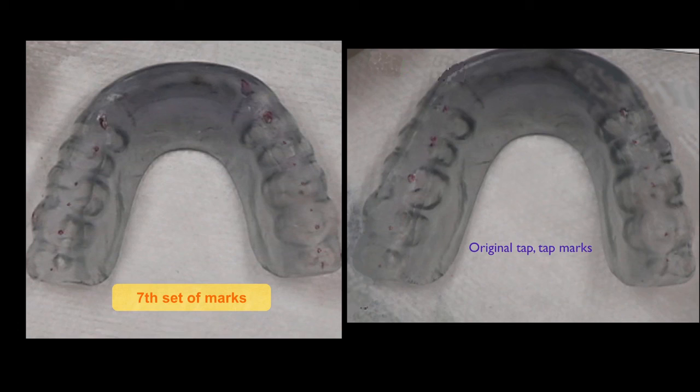Here is a comparison between the original maximum intercuspation marks and the marks achieved in the new centric relation position after 6 adjustments of the acrylic. They look about the same, but the TMJs have gone from an at-risk configuration to a much safer configuration.